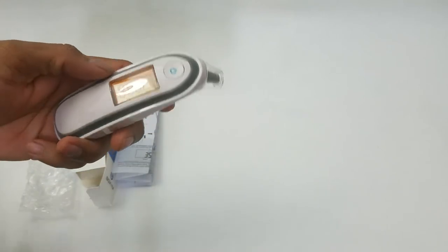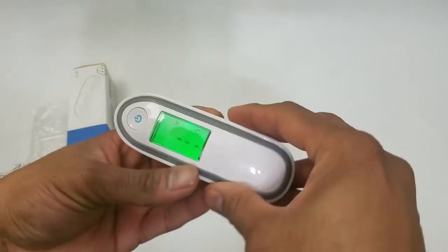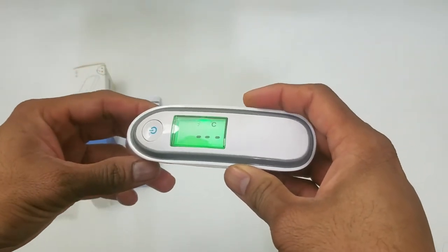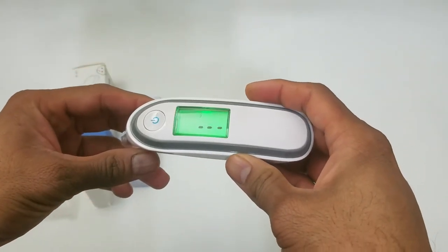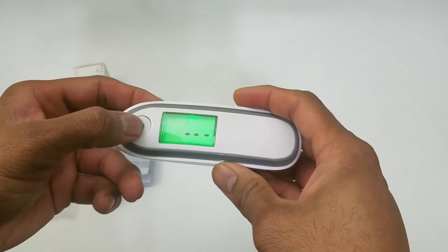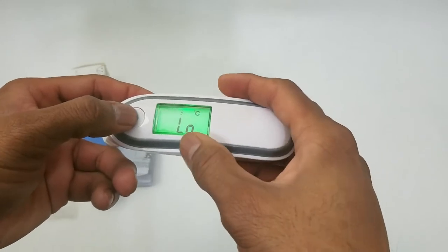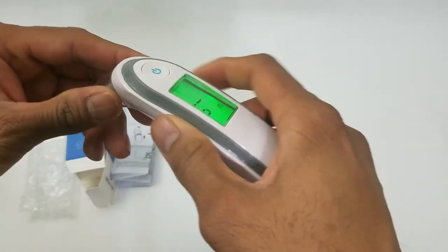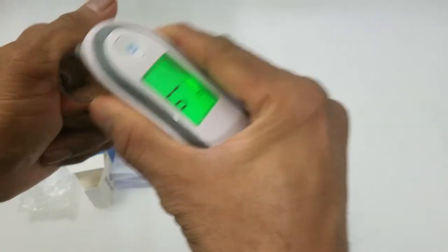Close and power on. Pretty straightforward. It's set to Celsius right now, and it will even show you if you have low battery, which is great to know.